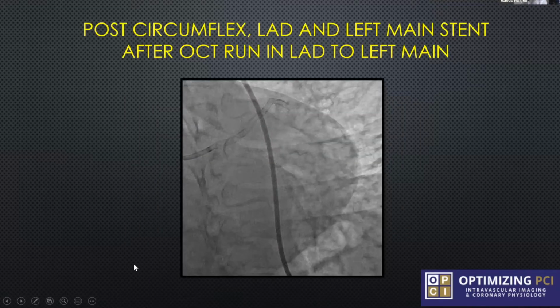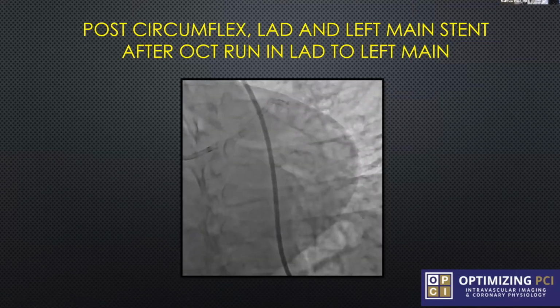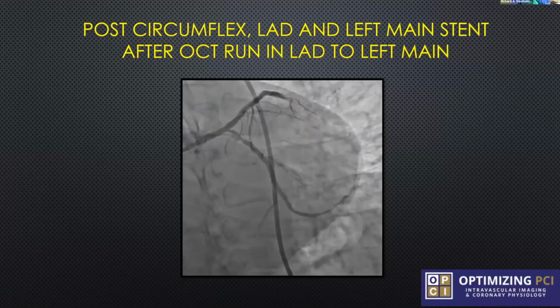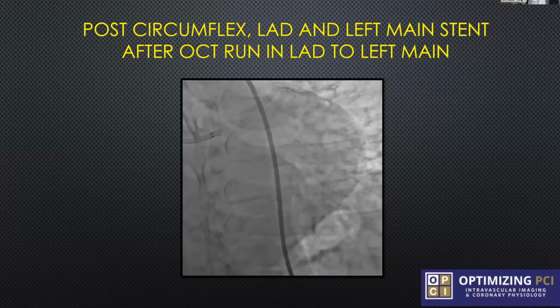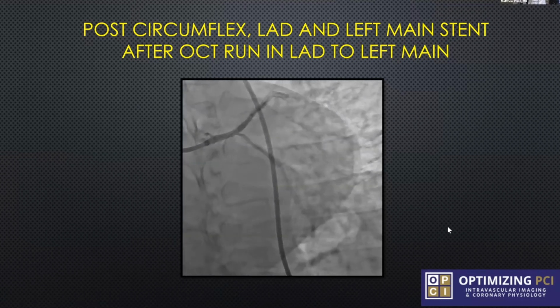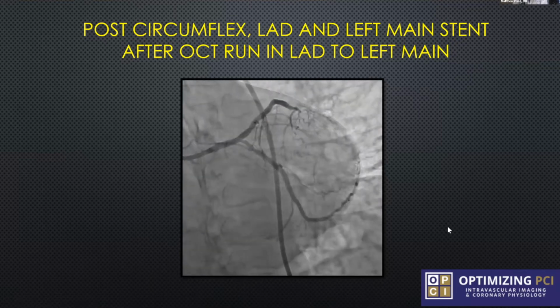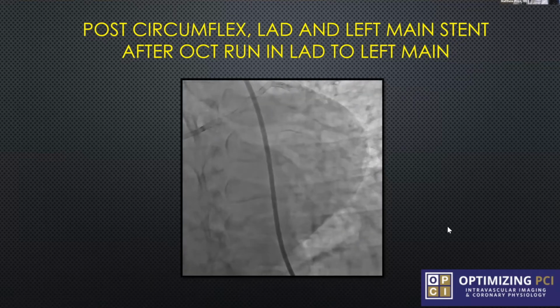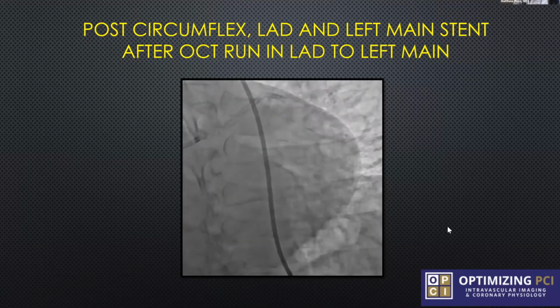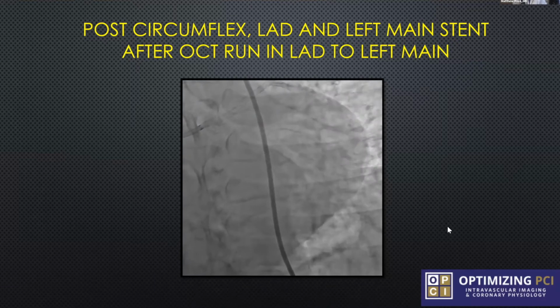Yeah. Richard, I'm going to stop you there. I'll keep you on time, but real quick, let's just talk about OCT in left main disease. For example, you had the OCT open already for the right coronary artery, but let's say this was the first vessel you were going to do. Would you have leaned towards intravascular ultrasound rather than OCT because of the extent of left main disease? Or if it's just the distal left main bifurcation, you're happy with OCT? Walk me through your thoughts.